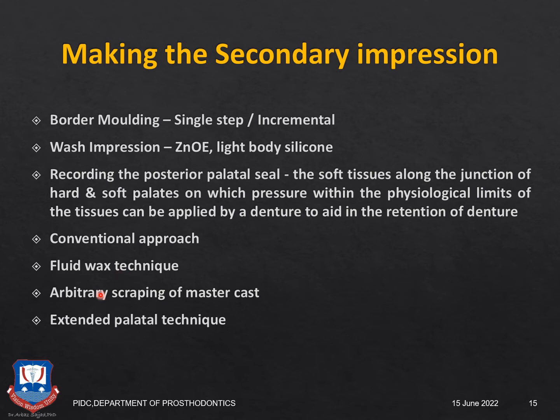The third is the least favorable but still does the trick, that is arbitrary scraping of the master cast. That is, on the master cast we scrape the postpalatal seal area to a certain depth.